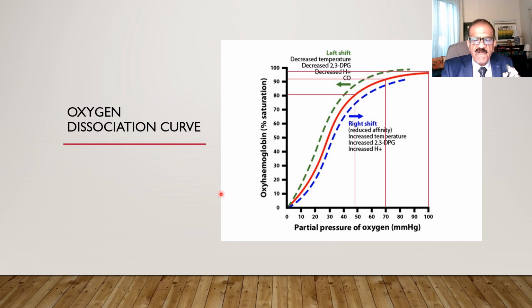But it is definitely very useful, because in a given person, if we know the baseline, somebody having a respiratory disorder, taking the example of COVID, before one develops pneumonia, his or her oxygen was say 95. Now if there is no further reduction from 95, then we are assured that there is no involvement of the lungs. If there is a reduction from the baseline, then we know that this patient is getting into trouble.